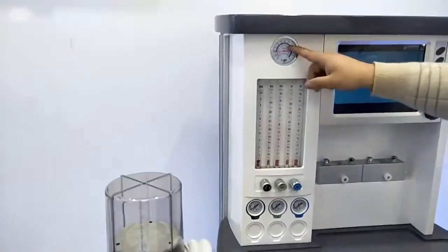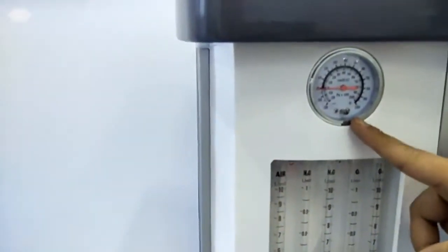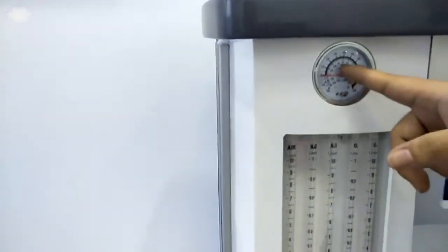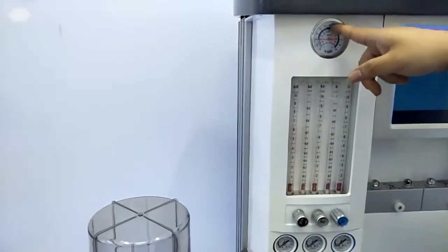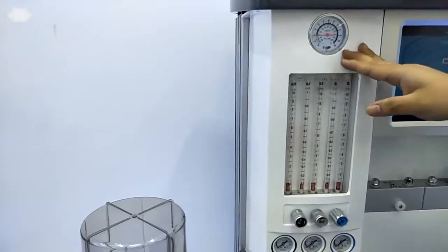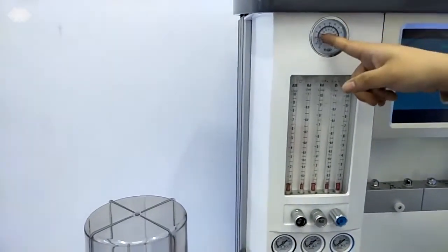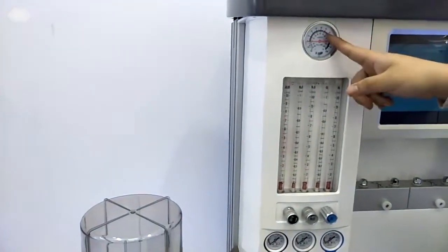And here we have a main gauge. This gauge is for checking the inlet pressure. Usually, if you get the inlet pressure inside, and here we see, for example, it points at 30, and then if you do nothing, after 1 hour or 2 hours, it will never go down. It means the machine has no leakage. So this is the main gauge.